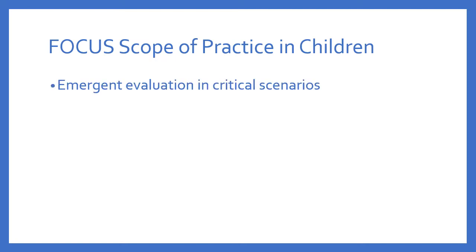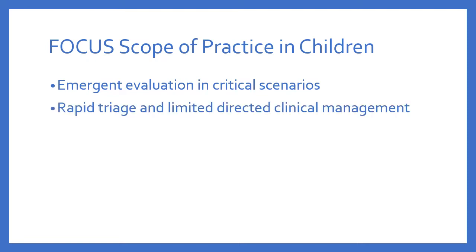So this really should only be used for the emergent evaluation of patients in more critical types of scenarios. So if patients need to be rapidly triaged to determine what unit they need to go to, or if we need to find out quickly what's going on with them so that we can direct clinical management, this is when we want to use focus.